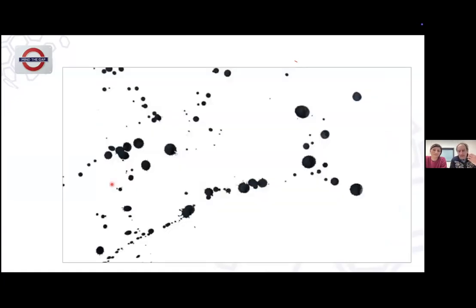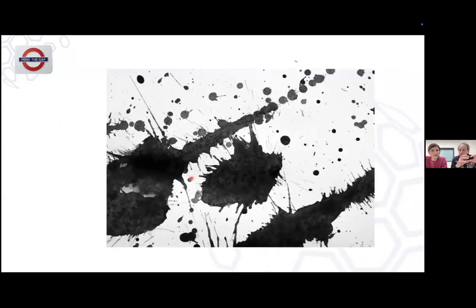And then if your ink spots are sparse, you may not see, or you may see discontinuous lines. But if the ink spots are close to each other, you start to see continuous lines. You see, this is why I think the gap is important, because the gap is an expression of how many molecules there are on that cell, you know?